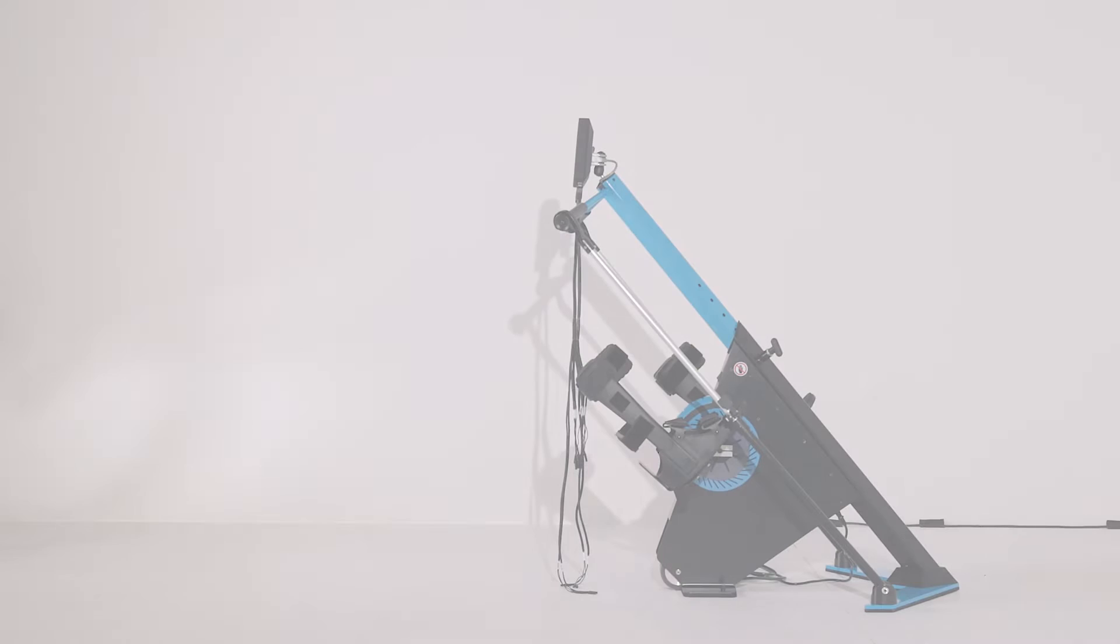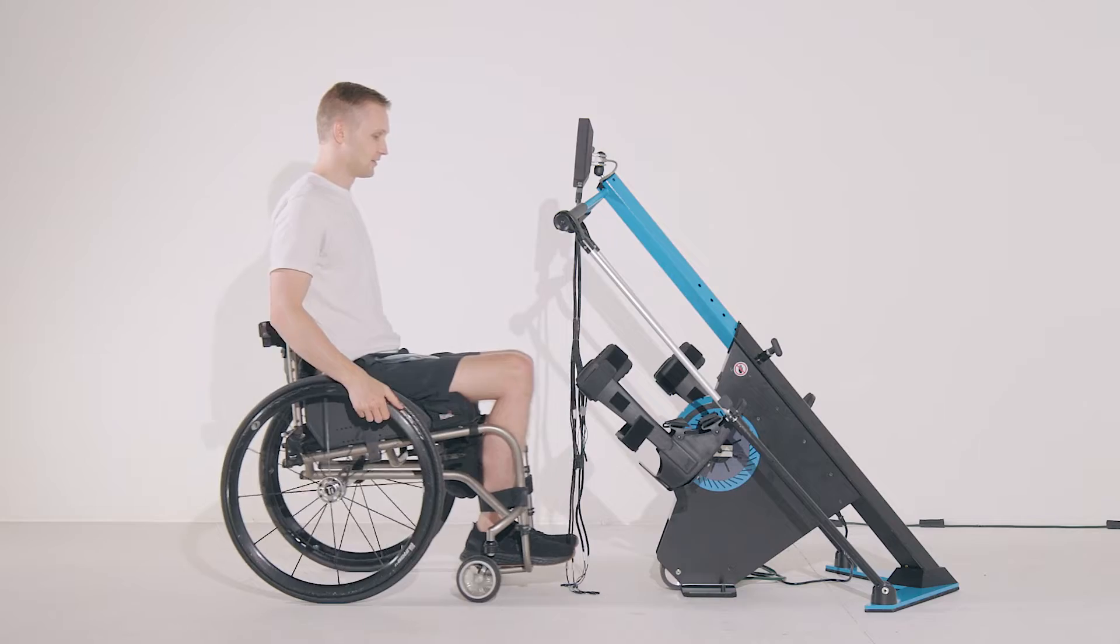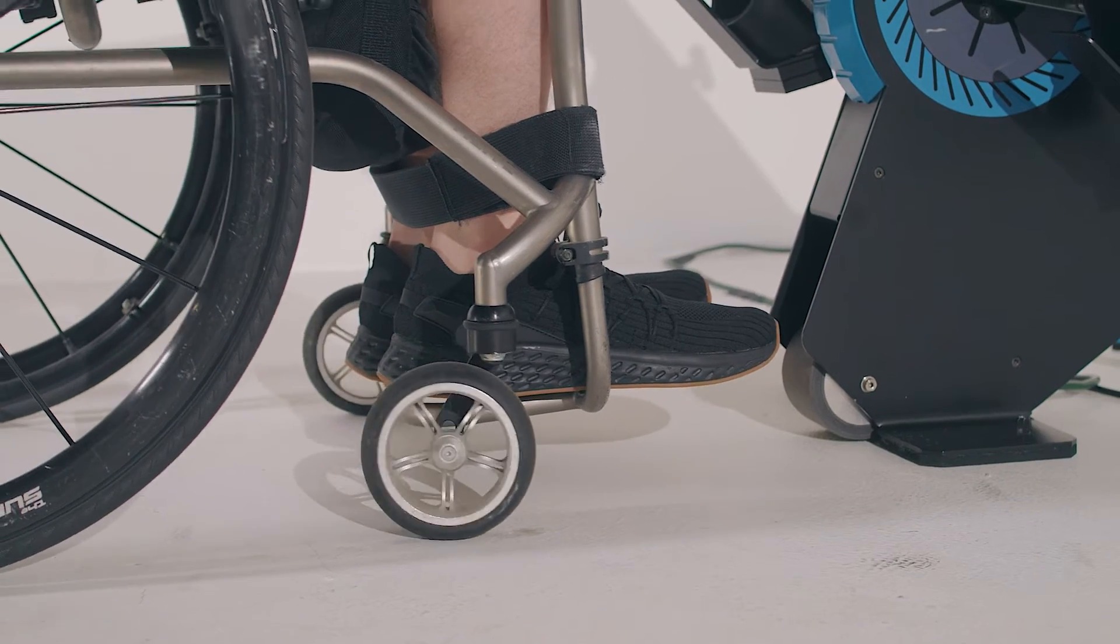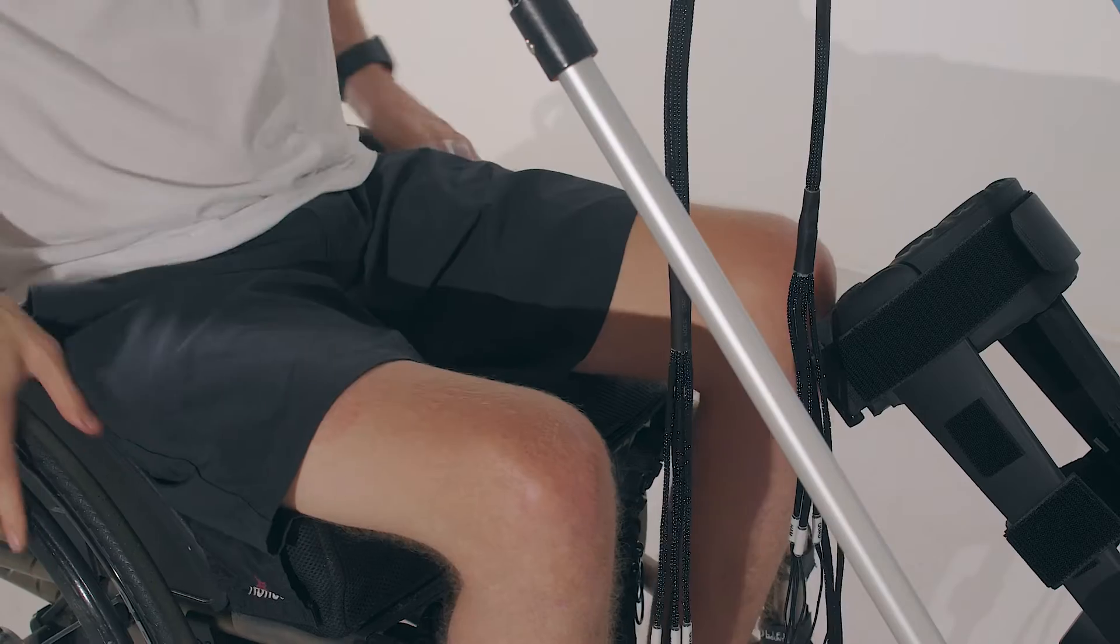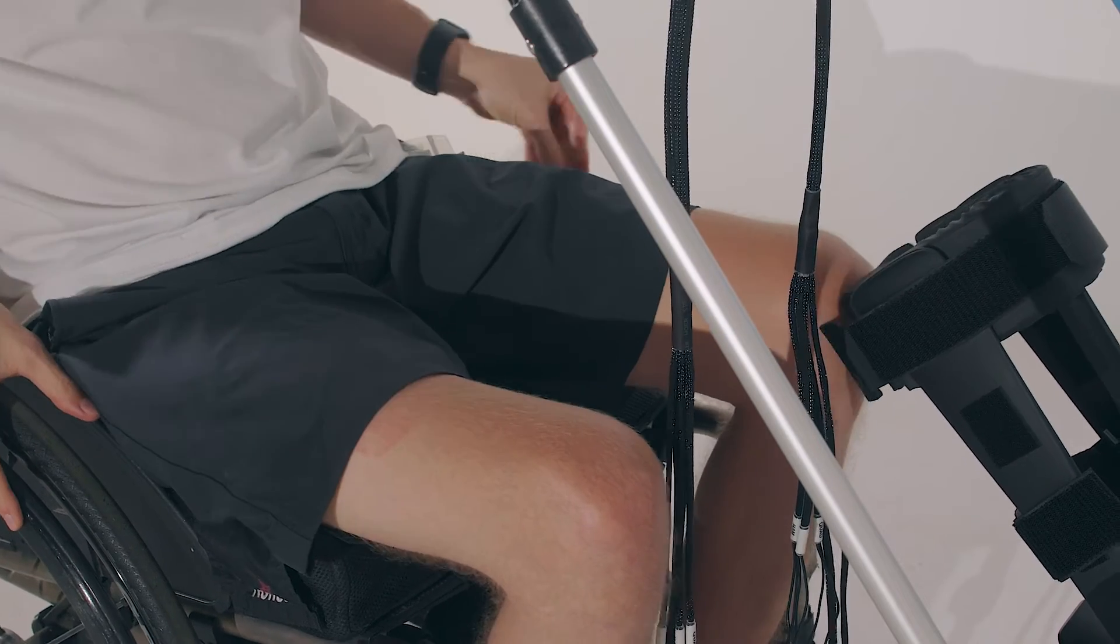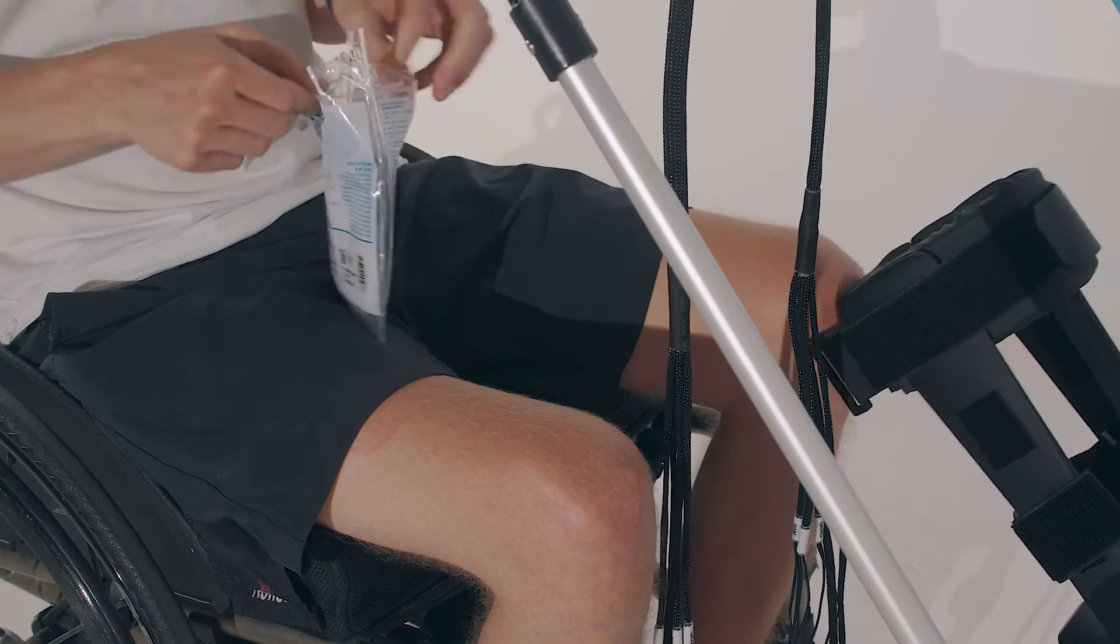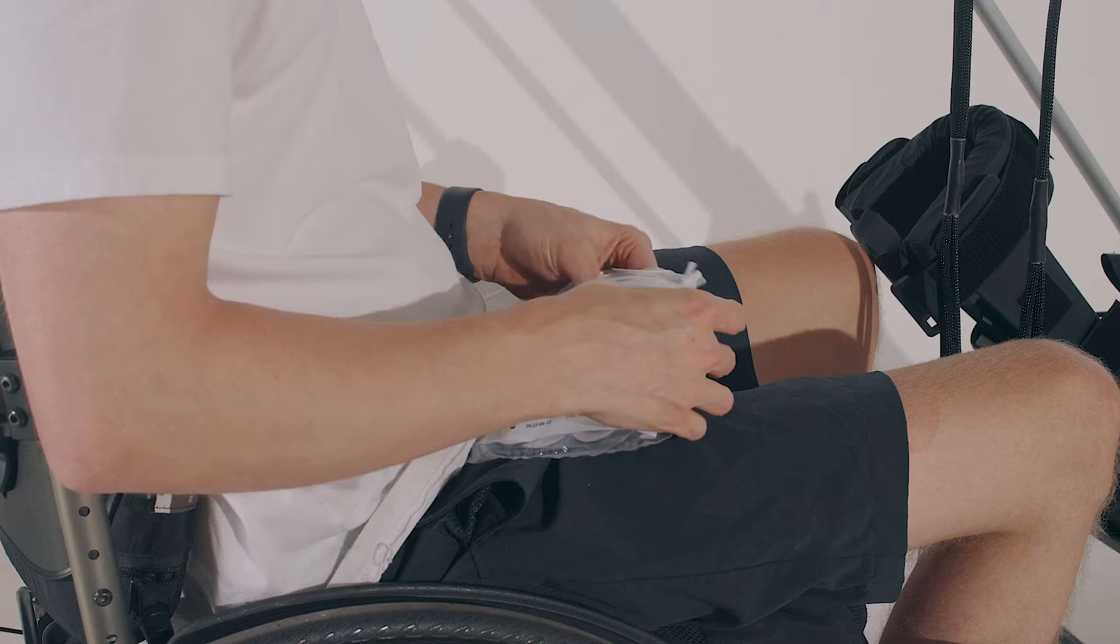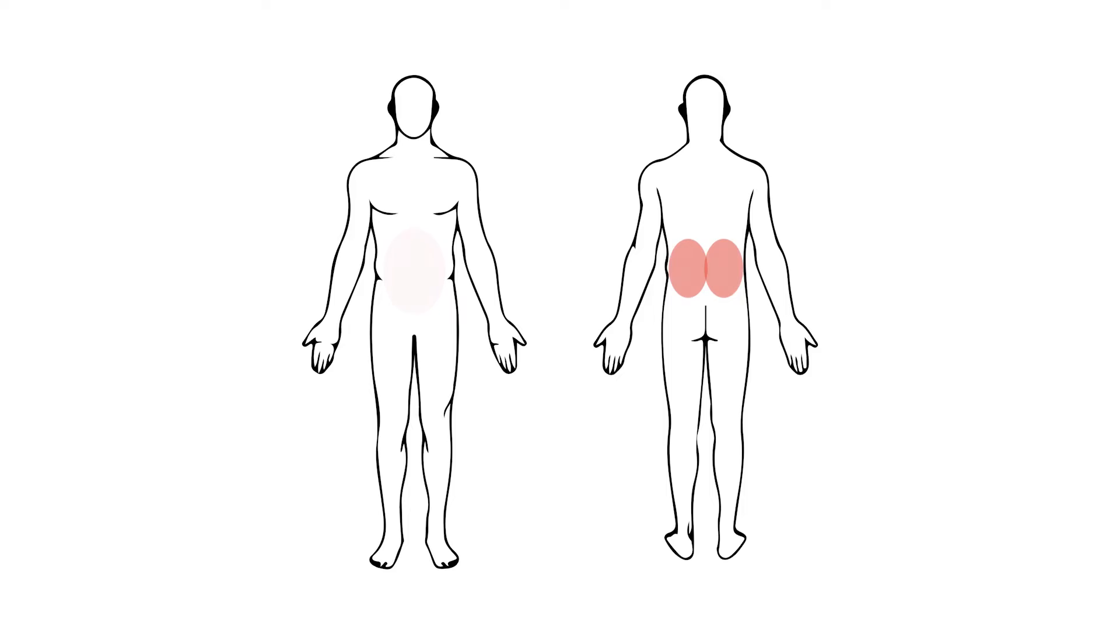To begin using the myocycle, approach the bike and center yourself. The myocycle can stimulate the quads, hamstrings, and glute muscles on both your left and right legs. If you have the PLUS model, you can also stimulate the lower legs, either gastrocnemius, your calves, or tibialis anterior, your shins, and the trunk, either the abdominals or the lower back bilaterally.